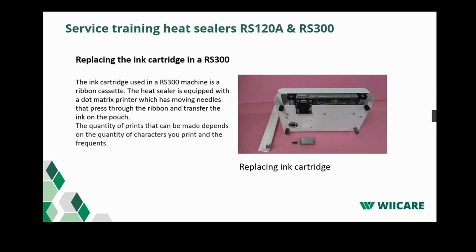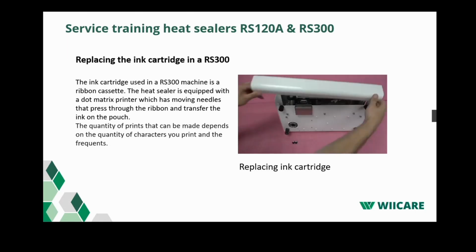Now you can reassemble the parts. First, push the printer cover back in its position. Now put the lower front cover back in its place and fasten it again with the knurled screws.